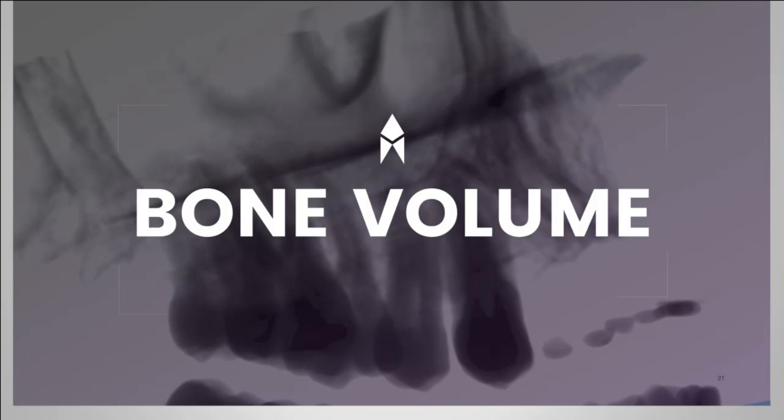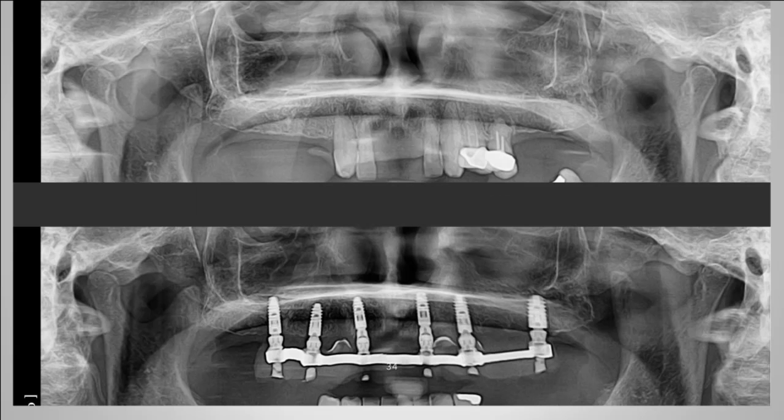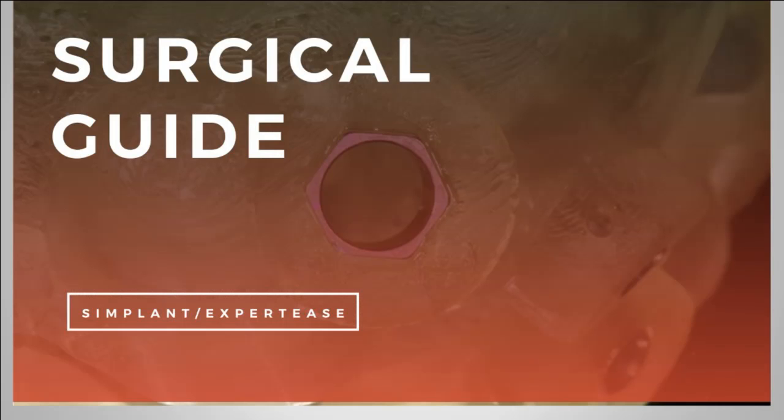Now, how does the bone volume affect this? We know that when we treat cases where we have a lot of bone volume, such as this one, we're able to place the implants upright. This is the case where we've used 6 implants. We've immediately loaded them, and there's a rigid bar to connect the implants. In a case with ideal bone volume, this has allowed us to restore the implants in the ideal place, and also to place the implants with a wide AP spread from the 6 to the 6.